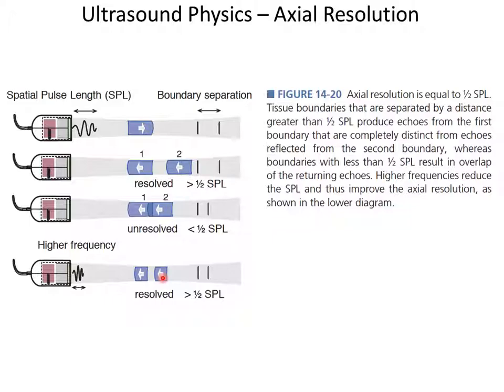If, on the other hand, you were imaging the carotid artery, which is right at the surface here, you don't have to go very far to see it, right? And you put that transducer on it. Let's go to 50 megahertz, right? Because now I only have to get in a few millimeters to look at the surface of the artery. But if I need to get into the chest and down into the heart, you need a depth of what, 10 centimeters, something reasonable like that.